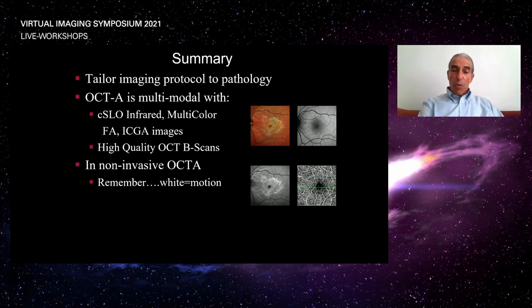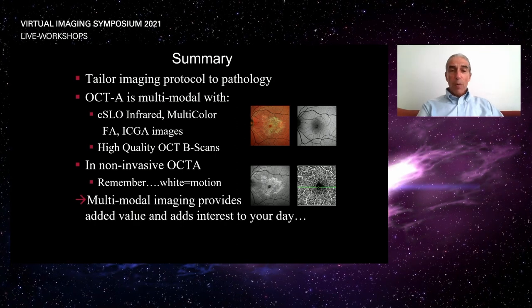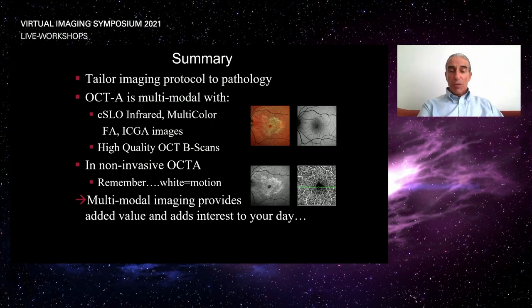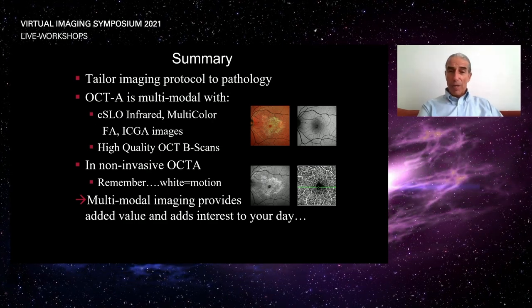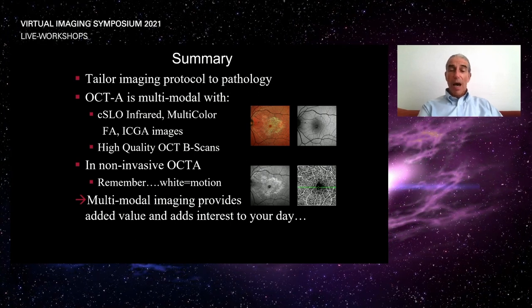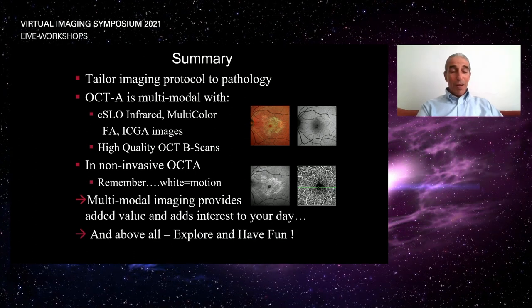Remember, white means motion. That's the most important take-home message about OCT angiography, what layer we are looking at. And of course, it adds interest to our day. The ability to take a switch and flick it and look at different areas of the retina or the choroid or combine two imaging modalities and have an aha moment really makes our work much more fun-filled.